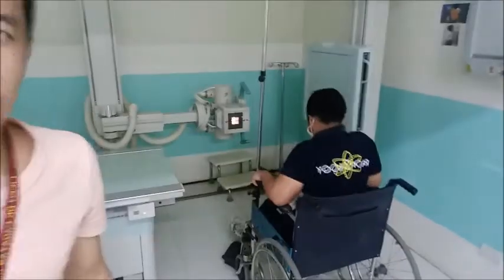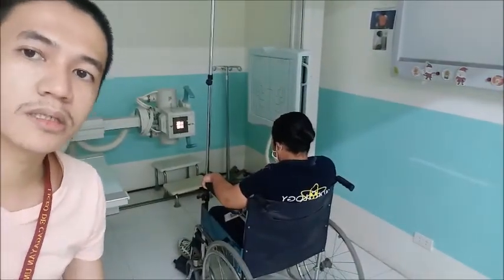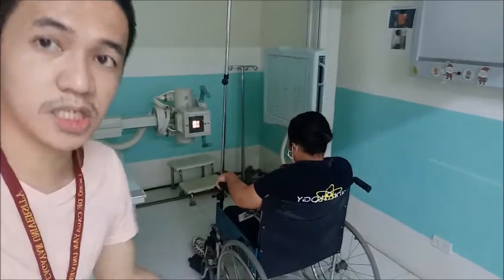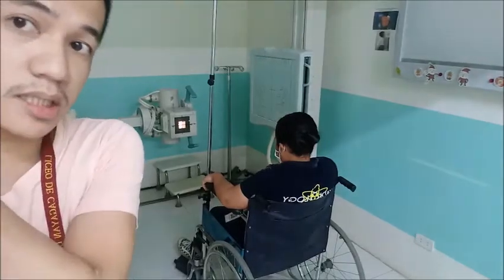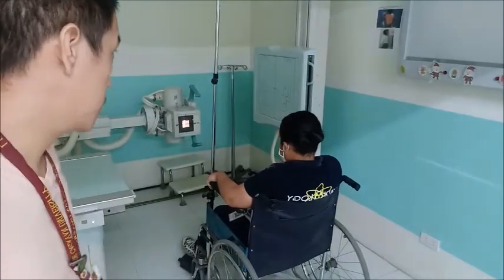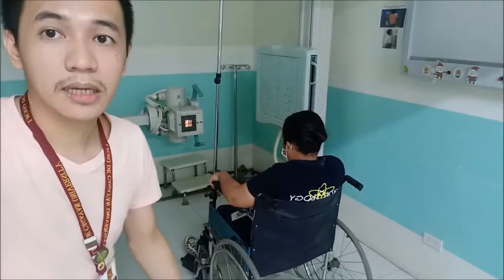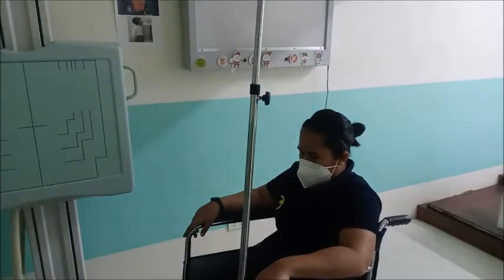Okay. So, question: can we do a chest AP instead of chest PA if the patient cannot stand? The answer is yes. Okay, so we have to modify, diba? That's the purpose na to sa being a rad tech. We need to modify the examination based on the condition of our patient.